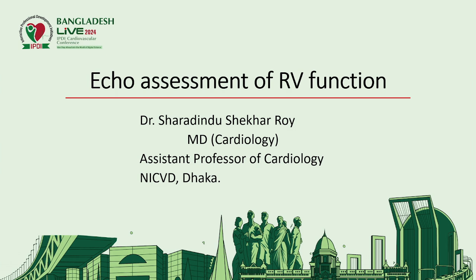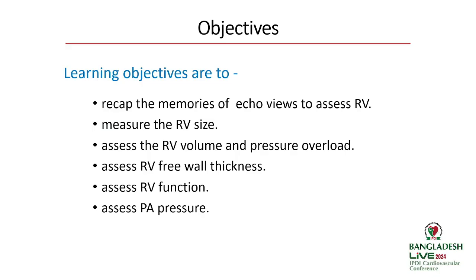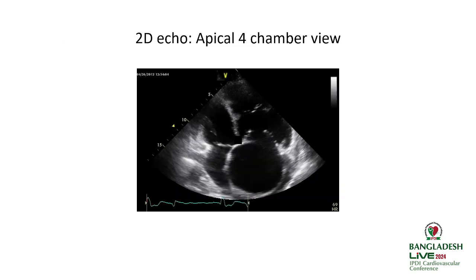But it's also a privilege for me to present on echo assessment of RV function. So let us forget the LV for the next couple of times, as the RV is the forgotten chamber, sometimes we say. My learning objectives today with this presentation are to recap the memories of our echo views, to assess RV, to measure the RV size, RV volume, RV function, and PA pressure.